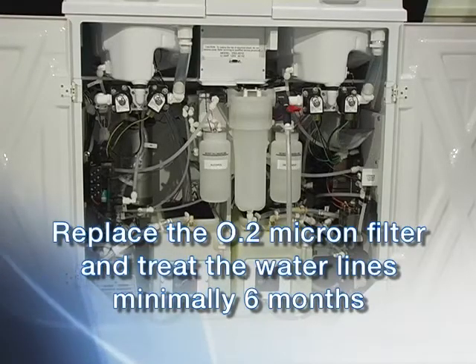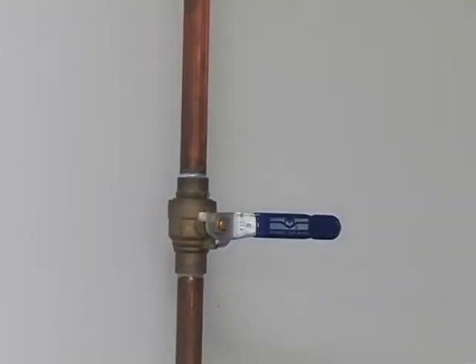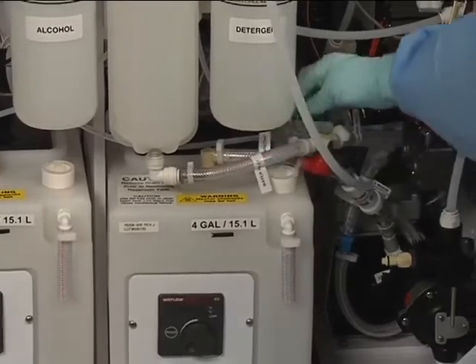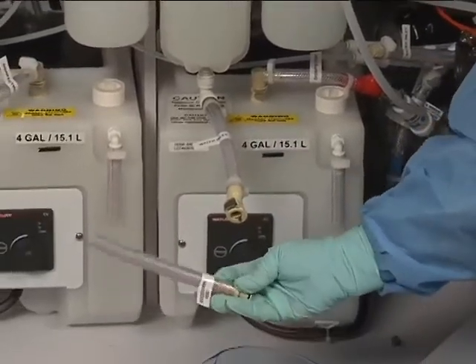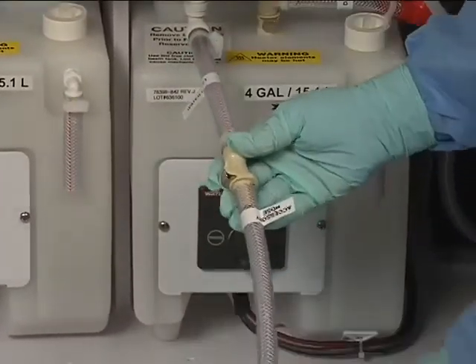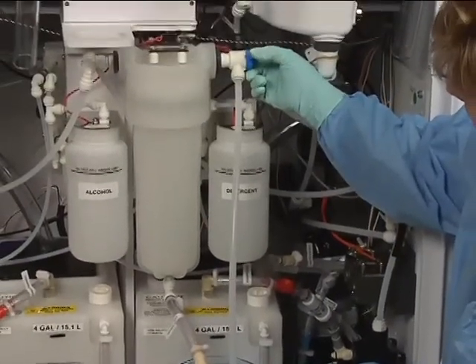The 0.2 micron water filter must be replaced and the water line sanitized at least every six months. An important step during replacement is checking for leaks and sanitizing the water lines. Water line treatment includes sanitization of the filter and lines for approximately one hour, or for the time programmed for the chemical used. The sanitation time is factory set — if you choose to sanitize for a different contact time, contact technical support or a clinical specialist. To get started, turn off the incoming water supply and disconnect the water inlet line. Attach the accessory hose.